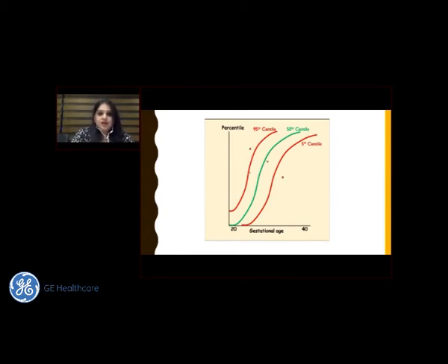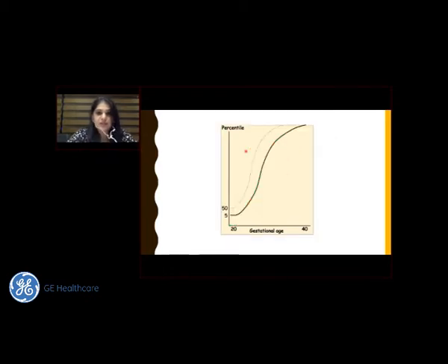Okay. Now these red dots which have come up, less than 5th centile is what is fetal growth restriction, and above the 95th centile is what is large for gestational age, which we would talk about in the later lectures. Okay, so serial monitoring is important. As you see, the abdominal circumference on day 1 could appear below the 5th centile, but as you see here, after 2 weeks, it's grown optimally. You chart that here. After 2 weeks, you chart it here.